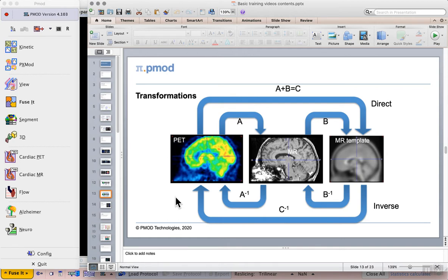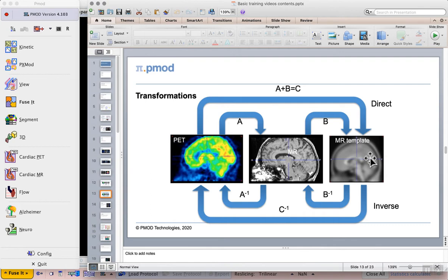In the exercise we're going to use now we will directly match a PET image to a PET template rather than an MR template so that we can quickly apply some of these Atlas VOIs and calculate statistics.